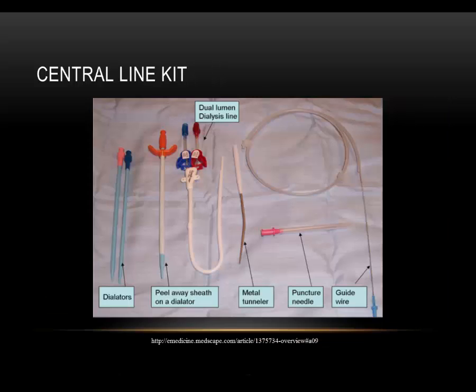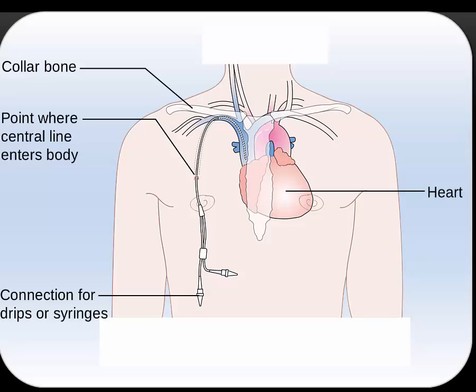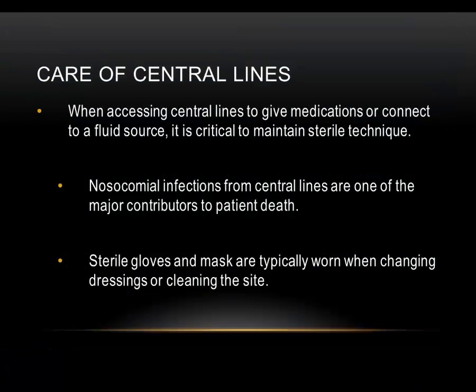Central line kits generally look like this example and include a puncture needle, a guide wire, dilators, and then the actual central line. All the tunneled lines have a polyethylene terephthalate cuff, which helps in the tissue fibrosis to anchor the line to the tunnel and decrease infection risk. Central lines are an open pathway into major vessels leading directly to the heart. It is important to maintain sterile technique and always wash your hands before and after touching the lines. It is important to wear the correct PPE and to keep the insertion site and sterile dressing dry.